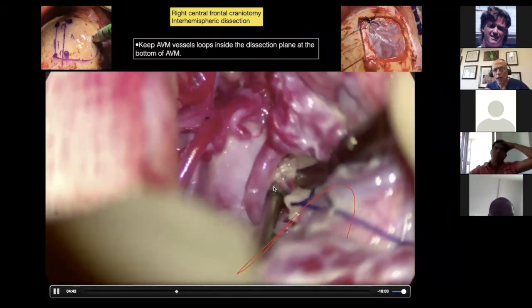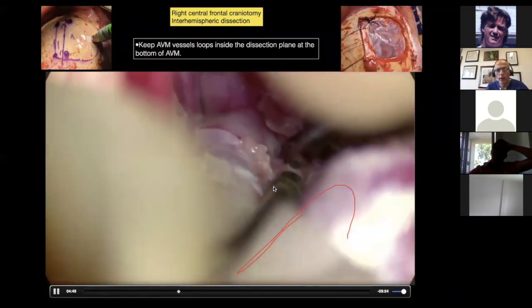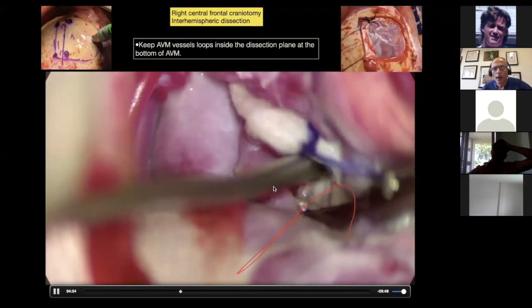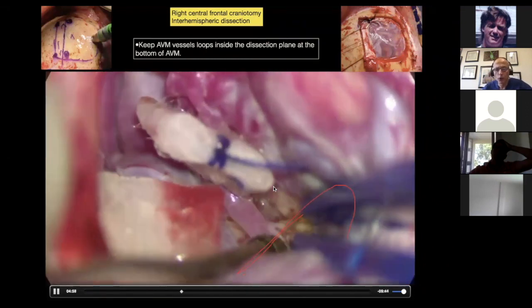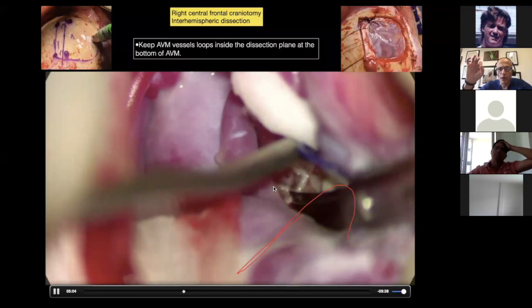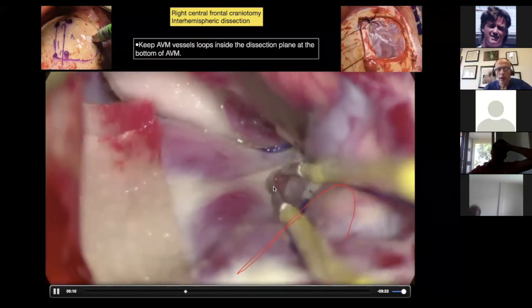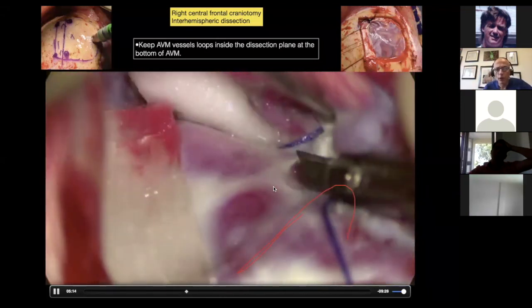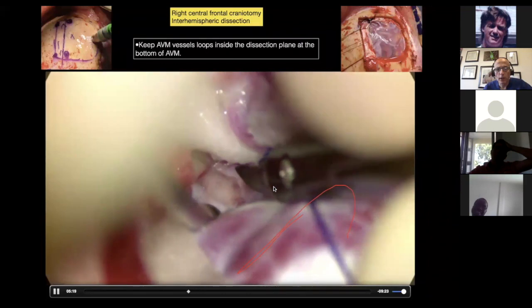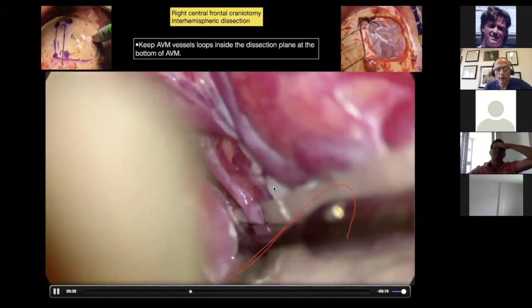So this transit artery is coursing over this gigantic varix, okay? Taking and cutting. Once you're sure, you coagulate. And Dr. Hiroshi calls this, if you do just one time, Mickey Mouse bipolaring, don't do that. So it's constant, okay? Gradual shrinkage of the vessel you are coagulating with the bipolar. Sharp dissection if necessary, okay? Protect the normal brain, protect the nidus.